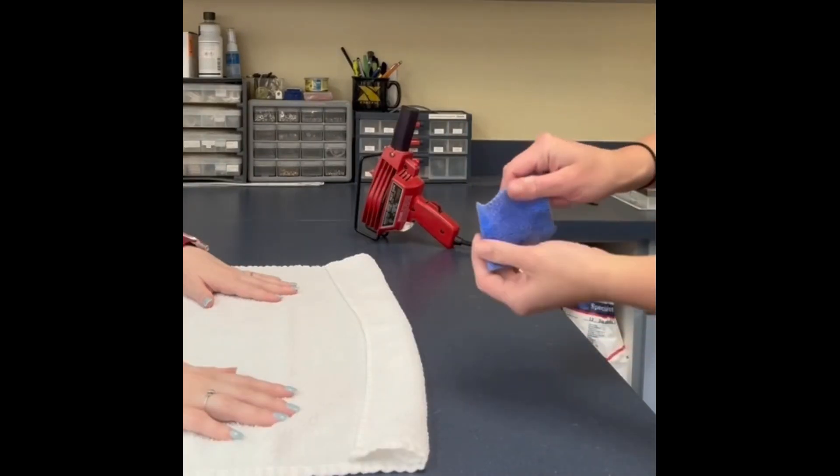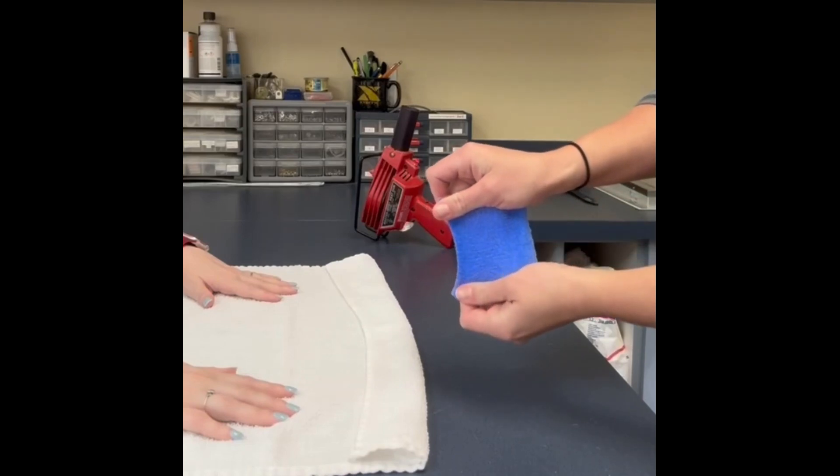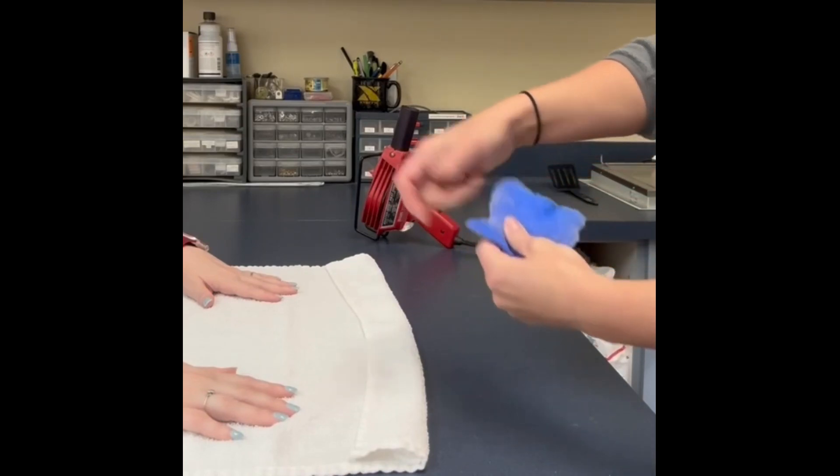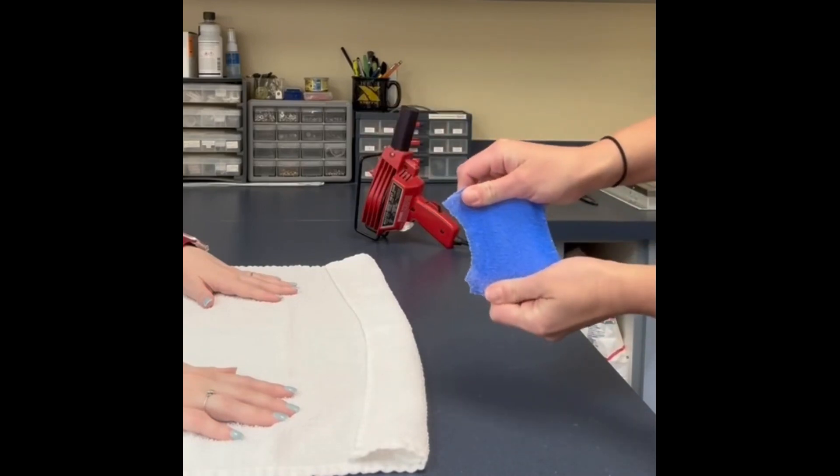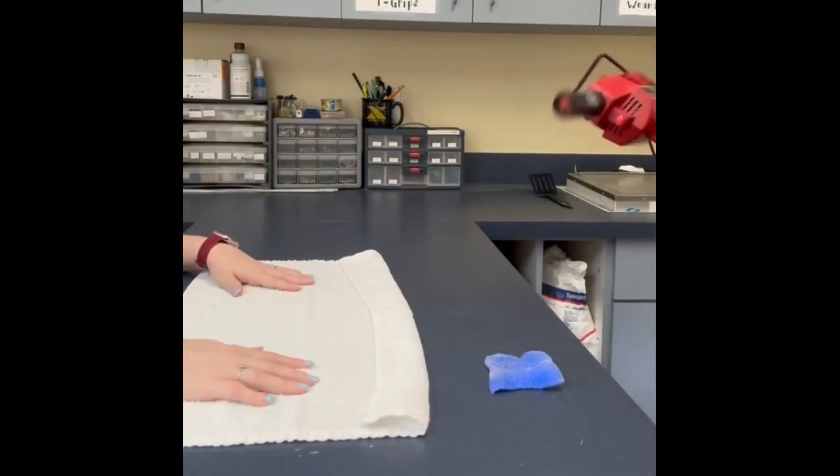Keep in mind that your working time with this material is not that long, so practicing ahead of time is key before fabricating the splint for your patient, in order to ensure it fits properly and is serving its purpose.